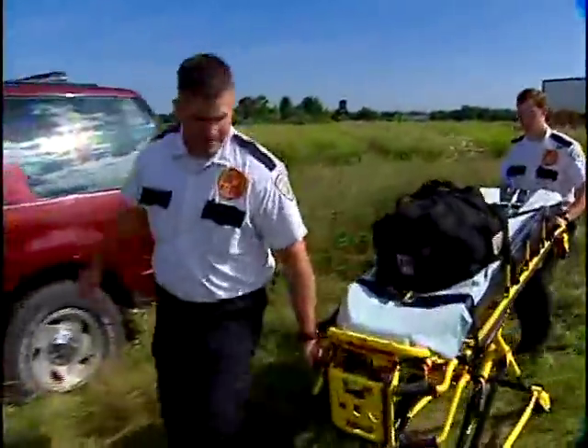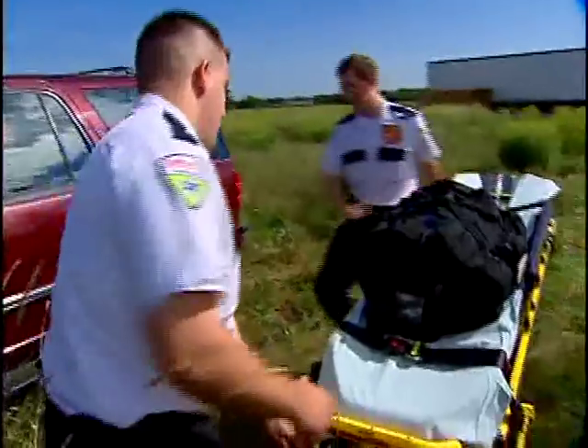The MX Pro's large casters just climb over grass, gravel, and mud, and the caster bearings are sealed to make sure that dirt and grit don't penetrate.